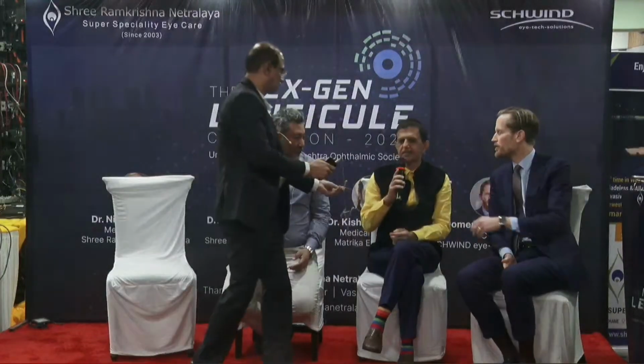So, what is your cutoff for LASIK or PRK? For LASIK, probably 500. For LASIK, it would be 480 to 500. And PRK? I don't do too much PRK, so probably similar.